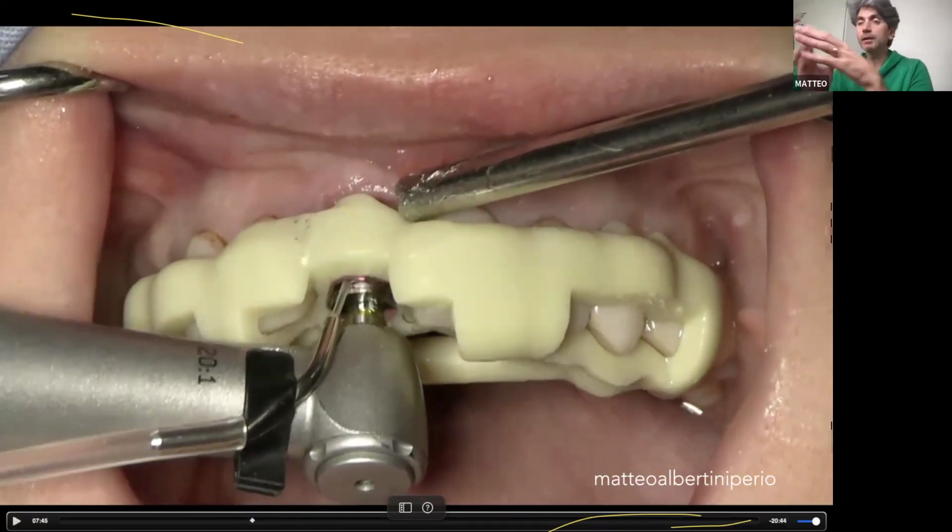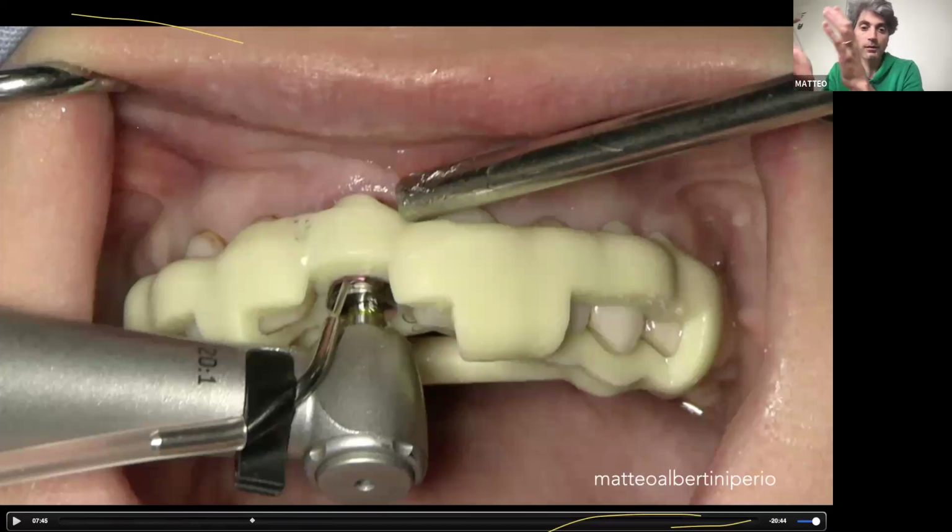So generally, you're gonna have problems with the 8 millimeter implants or maybe 10 millimeter implants because you use the first drill of the system, then you start with the 8 millimeter, the white one, then 8 millimeter, the yellow one, then 8 millimeter red, depending on the implant you're using, the red or the blue one.